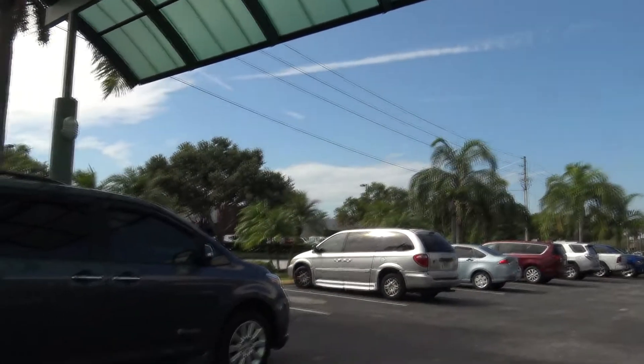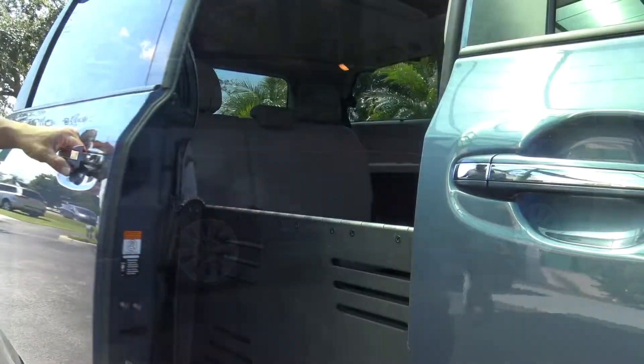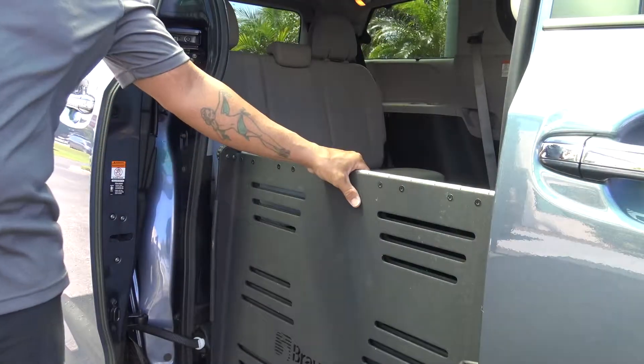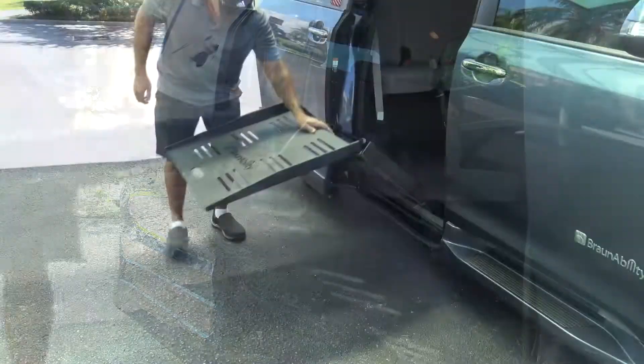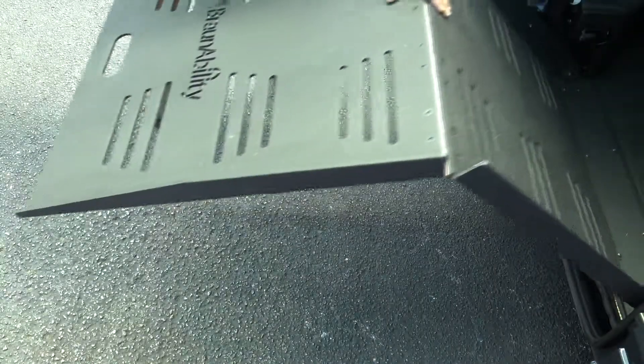If your power fold-out ramp won't automatically deploy for any reason and you need to enter the van, you may deploy the ramp manually. Start by grabbing the top of the ramp, then bring it out by applying pressure. This does take a bit of effort, but it will deploy. Also, make sure to keep your feet and or wheelchair clear of the ramp as it deploys.